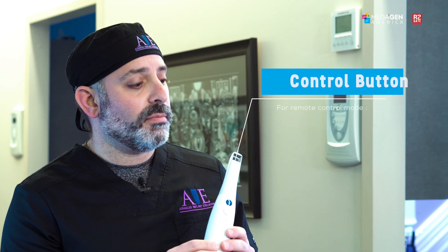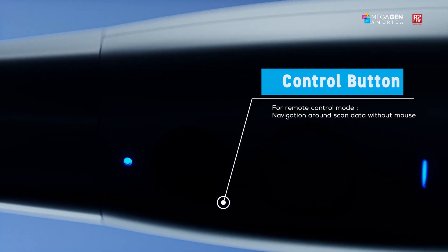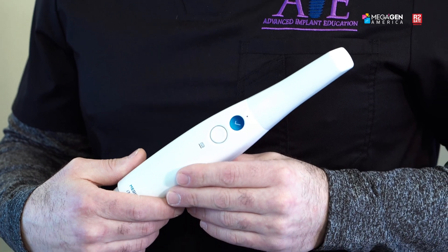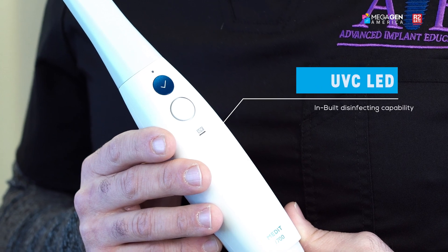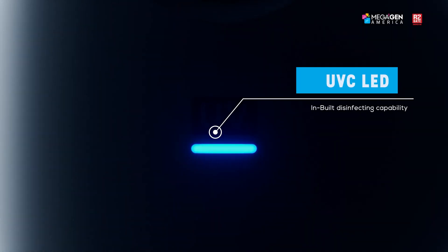One of my favorite features about the i700 is the new jog dial. Without ever having to go back to the computer, I can advance from the maxillary arch to the mandibular arch to the bite. I can zoom in and out, move objects, and even rotate through them — so from start to finish, once I put my gloves on, I no longer need to take them off. Additionally, there's a button that, when it lights up, activates UV light disinfectant, so we're constantly cleansing while scanning.